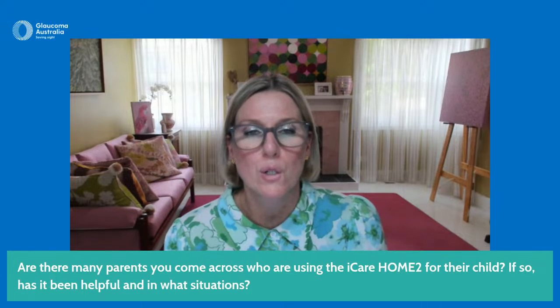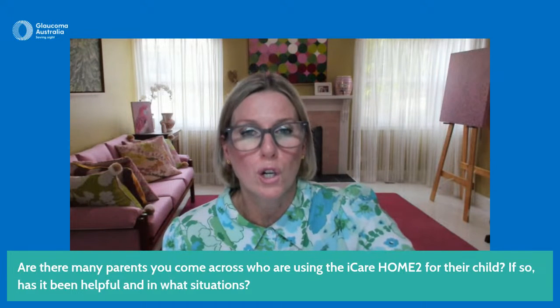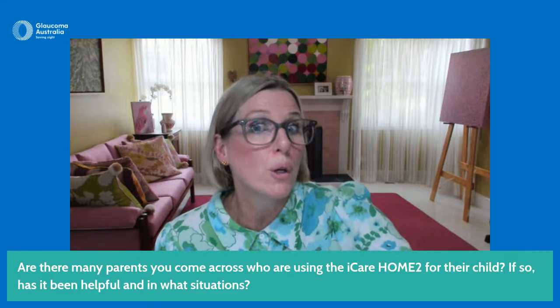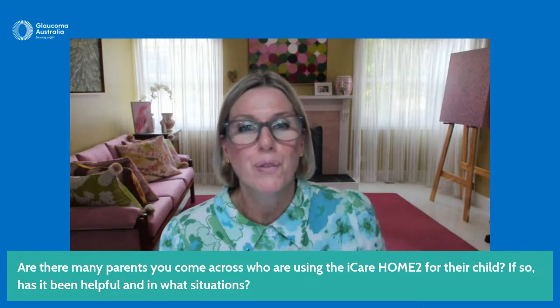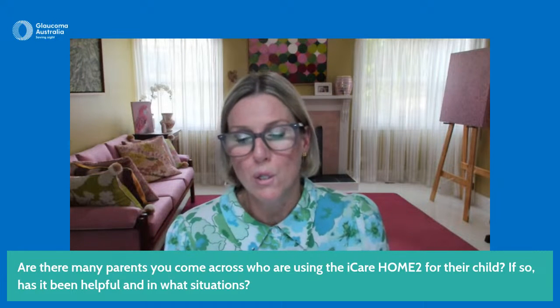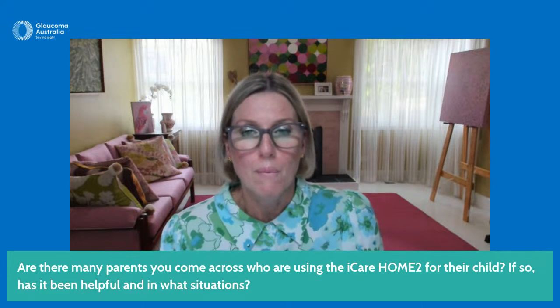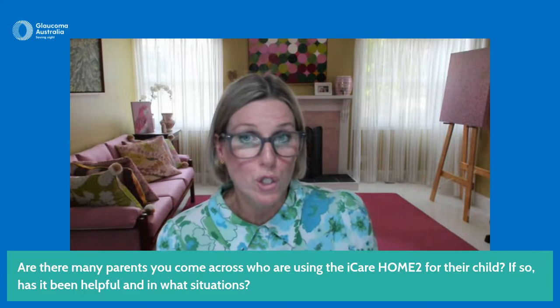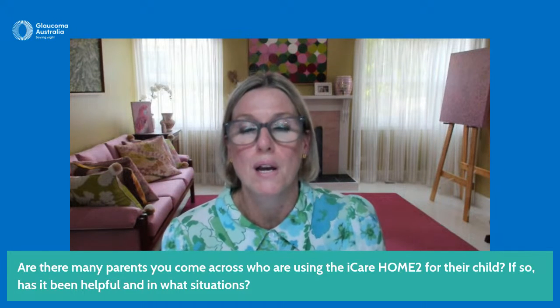And so we often recommend that you get every second visit with your local optometrist and go in and get the pressure tested. Now, for people that live remotely or are often traveling internationally with their families, this can be quite difficult. So in those situations, it can be useful to have an iCare HOME2. But normally, most people would have access to some sort of eye care professional close to them so that they can get that pressure checked intermittently closer to home as needed.